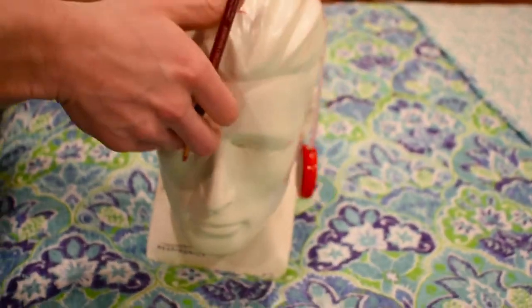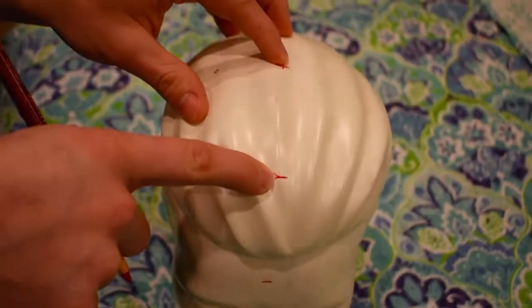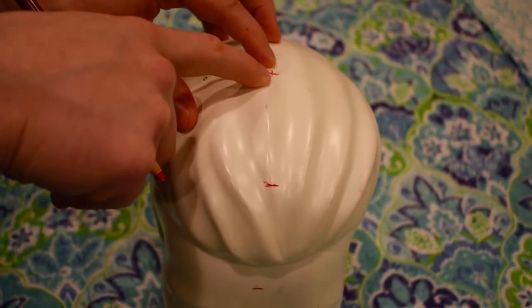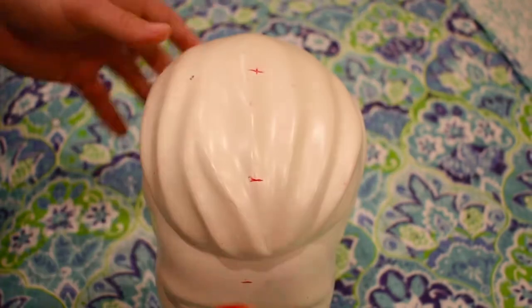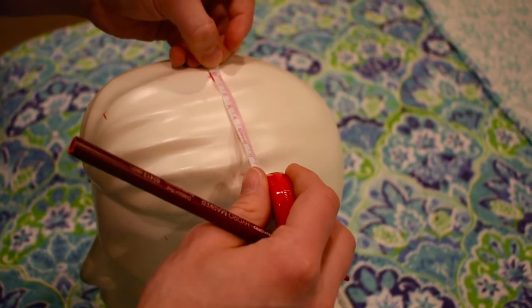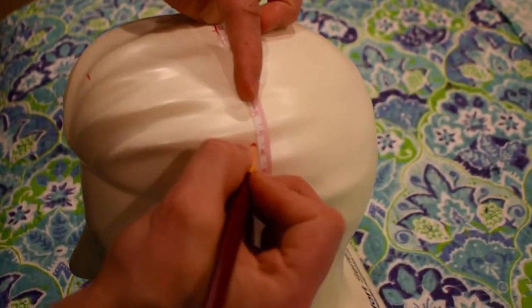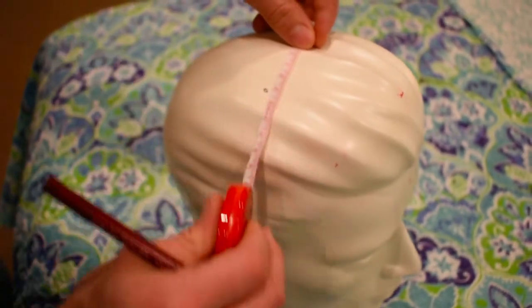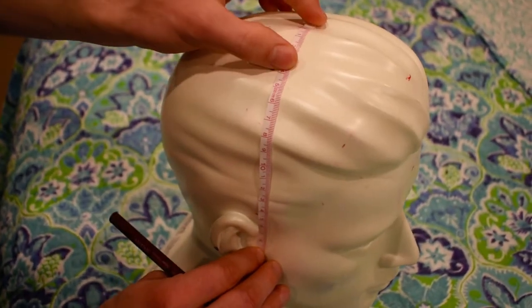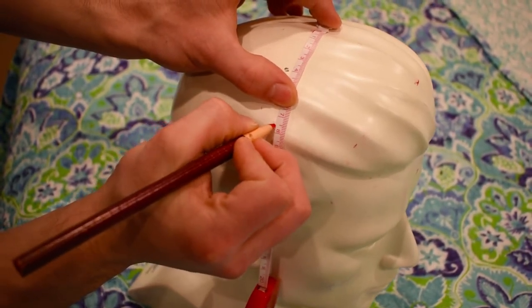Okay, and then the last measurements that we're going to do is, again like we did from the nasion to the Inion, 20% down. We're going to do 20% of that measurement down the sides of the head. So again, that's 7.6 centimeters, 20% of 38 centimeters. So we're going to measure 7.6. It's going to be right there. And the same thing on this side of the head. Okay, I'm going to turn it this way so you guys can see. Again, 20%, 7.6 centimeters. So it's just going to be right there.